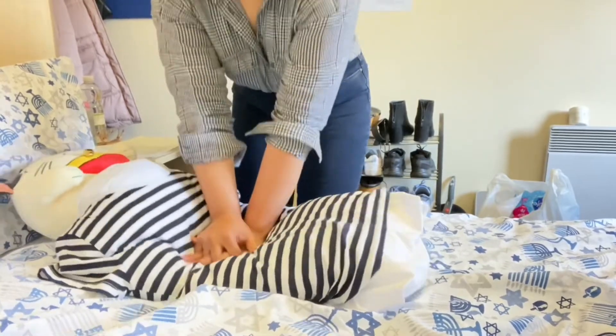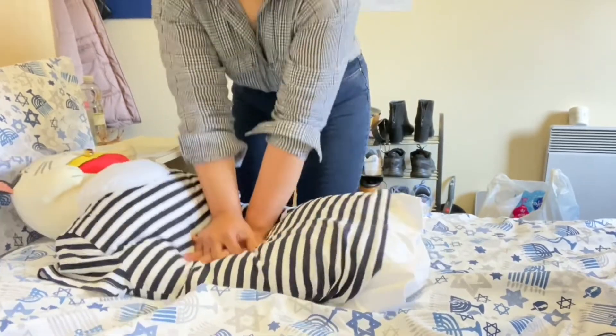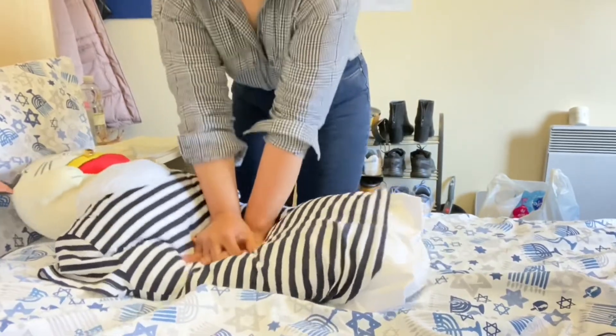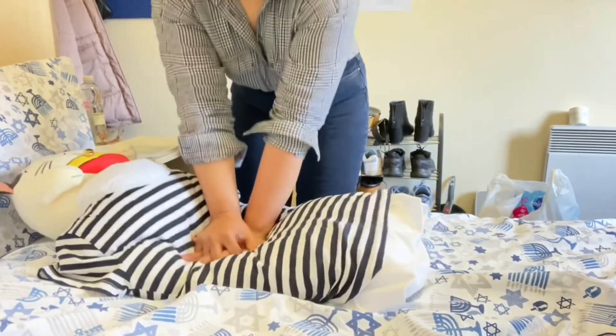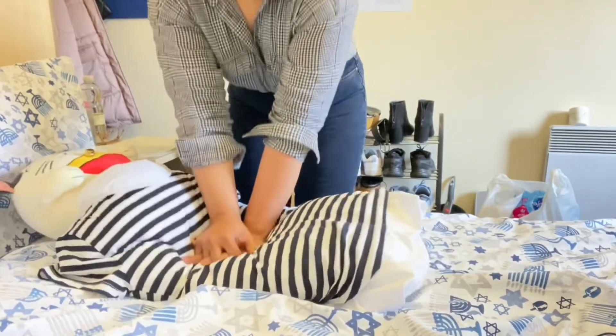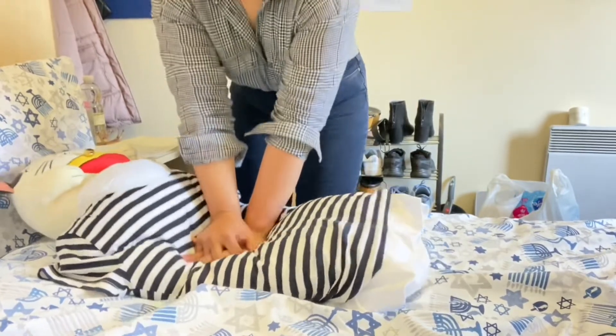I will do 5 to 6 cm depth at the rate of 100 to 120 per minute.